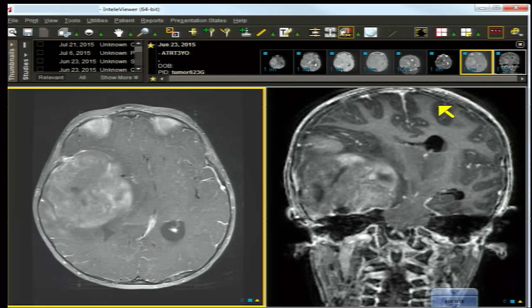Hemangioblastoma would not be a consideration in a one-, two-, or three-year-old unless there were von Hippel-Lindau disease — and even then, they are not seen that young. The average age at presentation is 30 years, making this patient about 27 years too young. If you see a hemangioblastoma, always check the globes for a prior retinal bleed: retinal bleed plus posterior fossa enhancing mass equals von Hippel-Lindau.